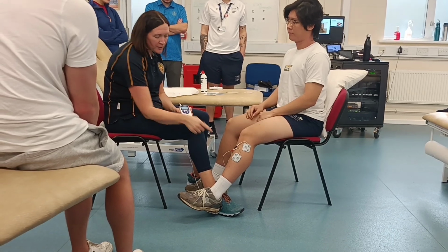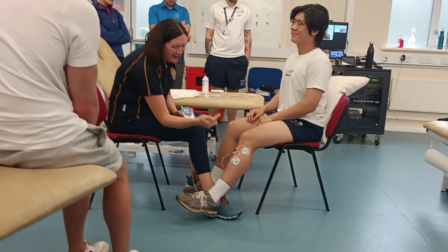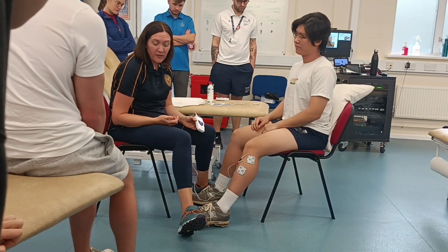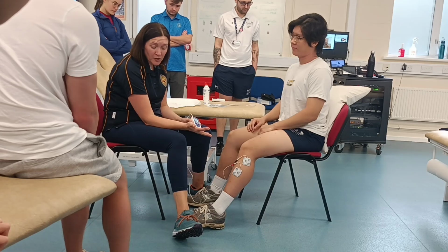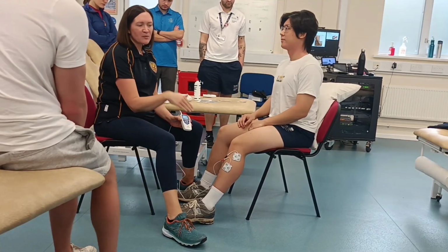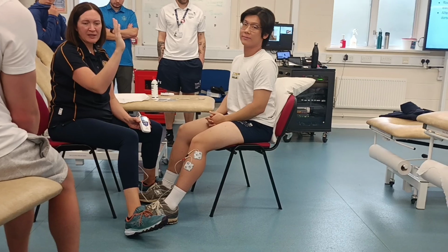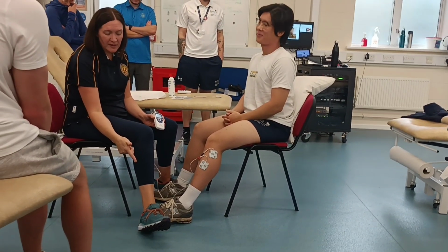Okay, I'm watching my patient's face to check that they're happy and comfortable with the treatment. But I'm also looking at the muscle belly to see, am I getting, I want dorsiflexion with eversion. And you probably think that it looks like too much eversion. That's the movement that I'm after. When you stand up and you're dorsiflexing and everting in swing phase, if you stand up against gravity, it dampens down. So that's the movement I'm looking for in sitting.